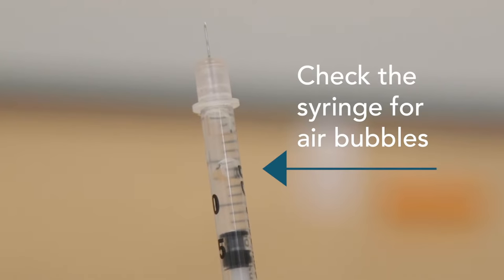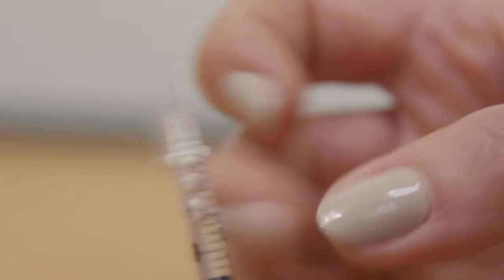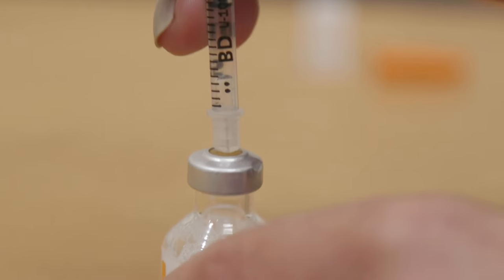Check the syringe for air bubbles. If bubbles are present, hold the syringe straight up and tap the side until the bubbles float to the top. Push any bubbles out and be sure the correct number of units are in your syringe.